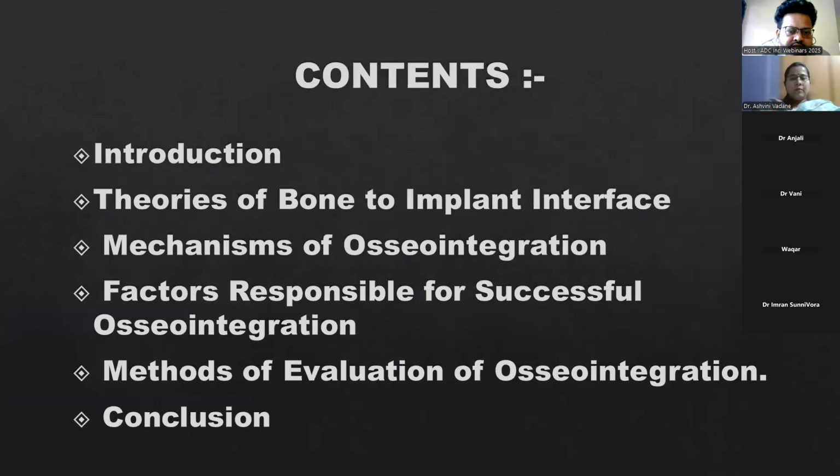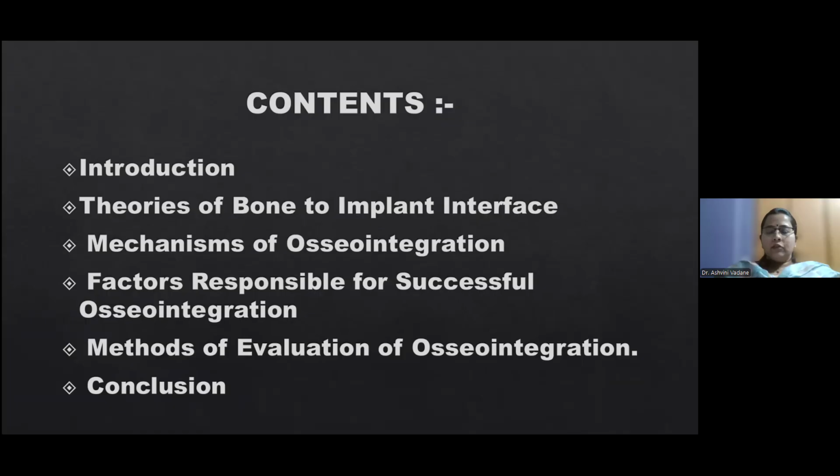The contents of today's topic will be introduction, theories of bone to implant interface, mechanism of osseointegration. There are various mechanisms. We will go through that. Then factors responsible for successful osseointegration, then methods of evaluation of osseointegration, and then the conclusion. The word osseointegration itself indicates: osseo means bone. So how the implant integrates with the bone, that is all about osseointegration.